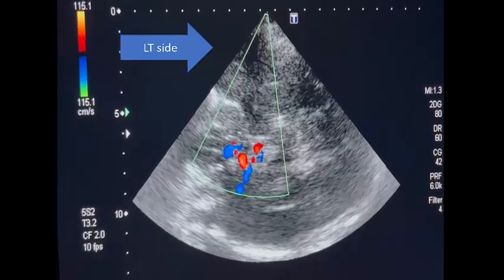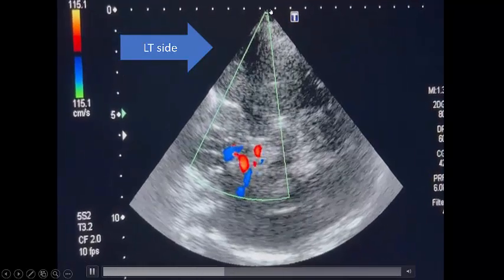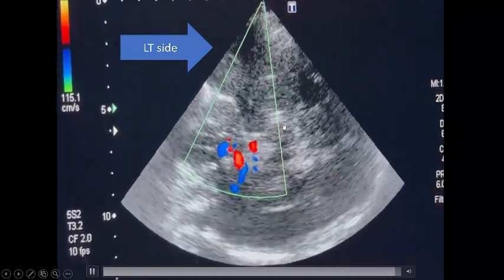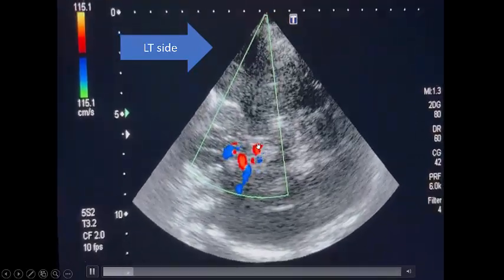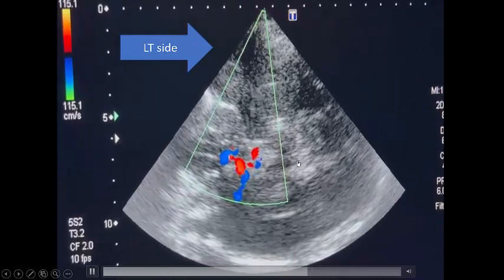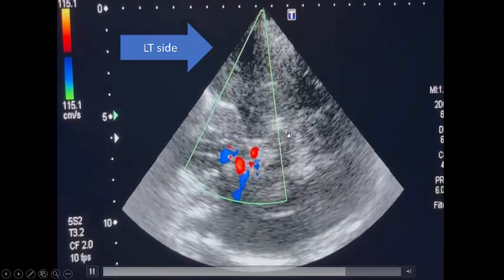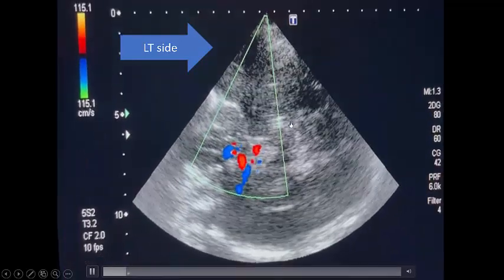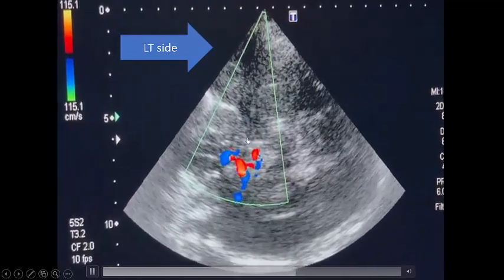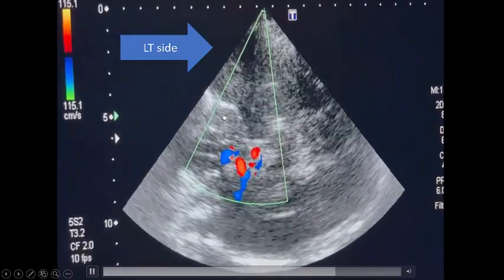We did TCCD in our patient, and as you see, this is the temporal view. Here I am at the left temporal window. Here is the butterfly hypoechoic midbrain, which you should see before commenting on the TCCD. This is the butterfly, heart-shaped midbrain. I'm here on the left side, I'm here on the right side. Too much blood flow in the right side and no flow in the left side at all.